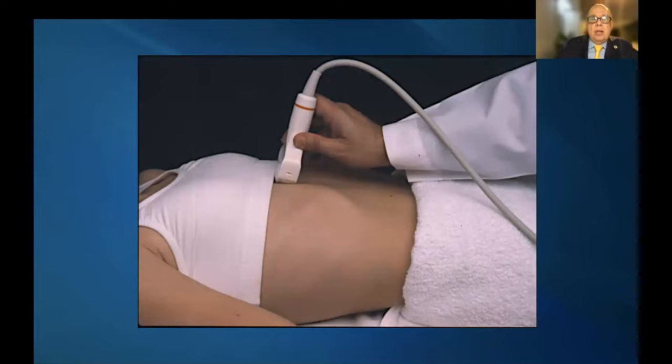Let's see where to place the transducer in order to make the assessment of the aorta and the inferior cava vein. I recommend starting in the epigastric area with the transducer in transversal position. We can always look for the mark. This mark, the north of the transducer, can be oriented to the right in transversal positions, or must be oriented to the head in longitudinal position. This is an international agreement on how to place and rotate the transducers.